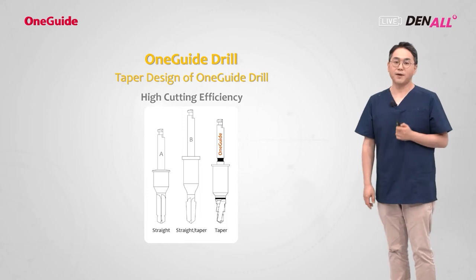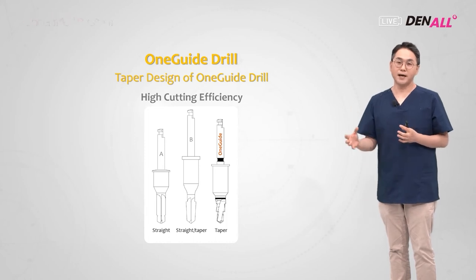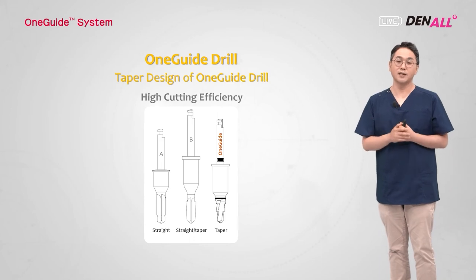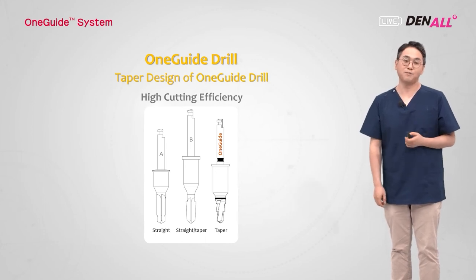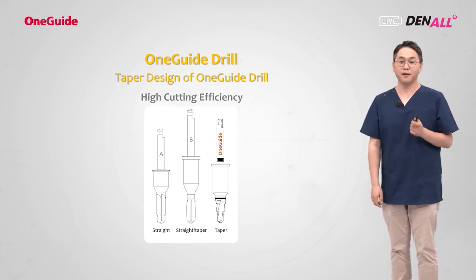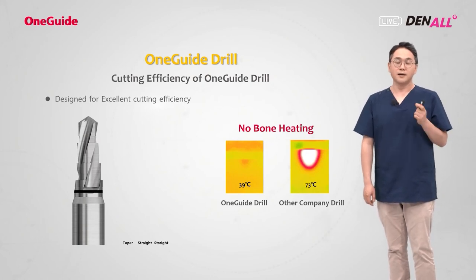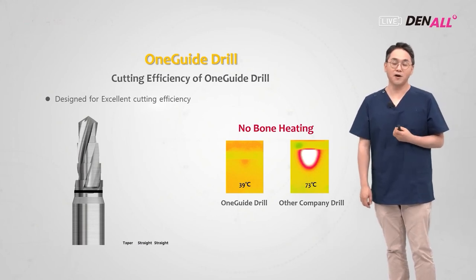The characteristic of the OneGuide drill is that it is tapered. TS3 implants have a tapered body to increase stability and coordinate the interfering bone amount between the bone and the implant. Tapered drill will be better than the straight type. The straight drill is not good for accurate site preparation for tapered body implants, so Osstem adopted tapered drills. Other companies have straight drills or drills tapered apically and straight in the upper part. I believe you have already experienced excellent cutting efficiency of the tapered drills using the taper kit.